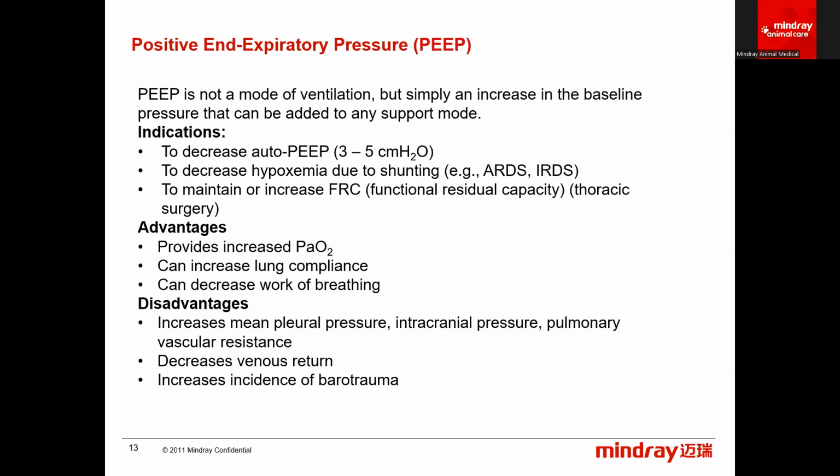Some advantages: you get a higher PaO2. You can help to increase your lung compliance, and it decreases the work of breathing. Like I said, do you want to forget something upstairs? Actually, I should be saying downstairs. Do you want to forget something downstairs halfway up the stairwell, or once you're already all the way up the stairwell? No, you don't want that. You want to decrease your work.